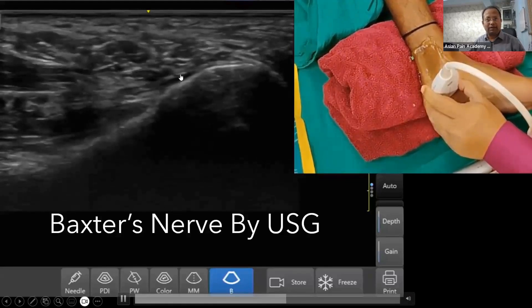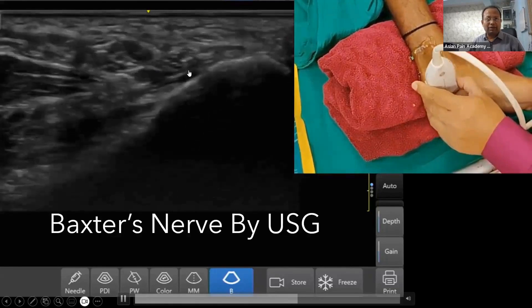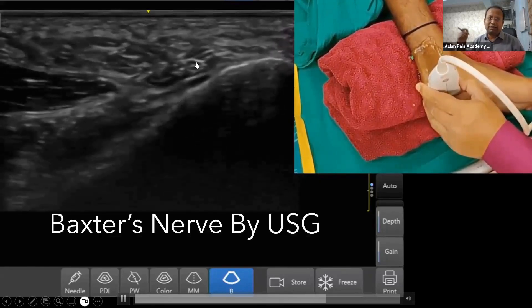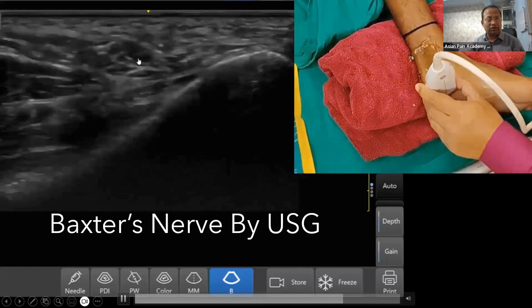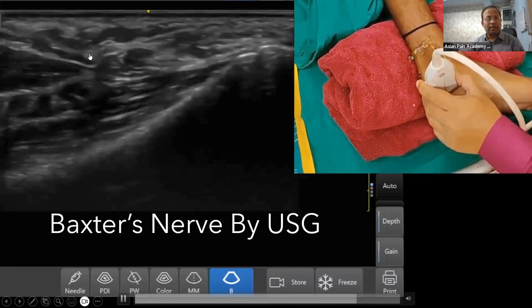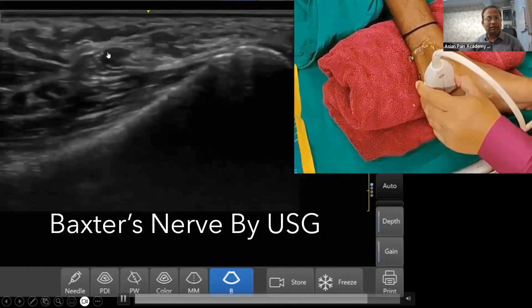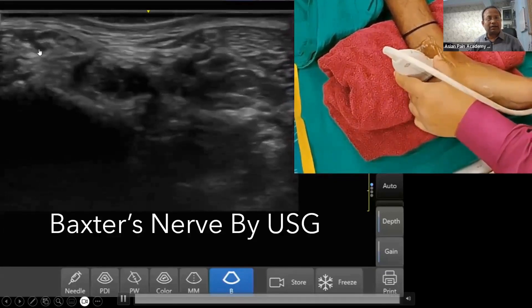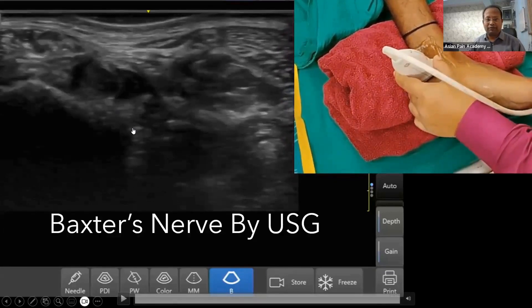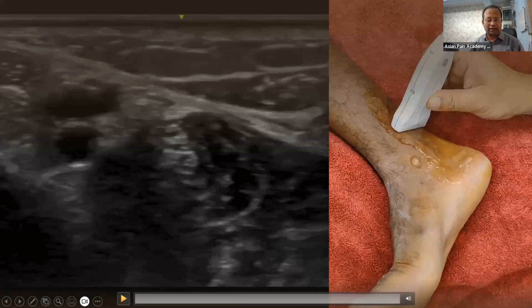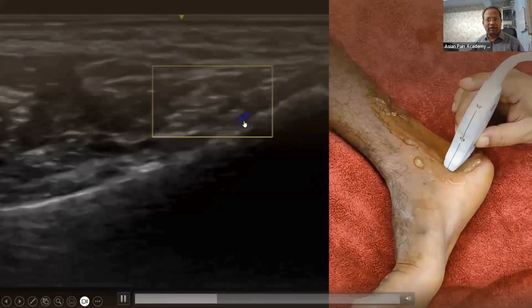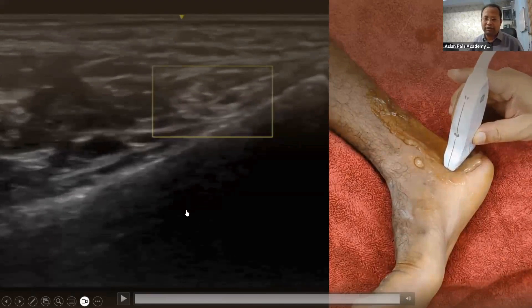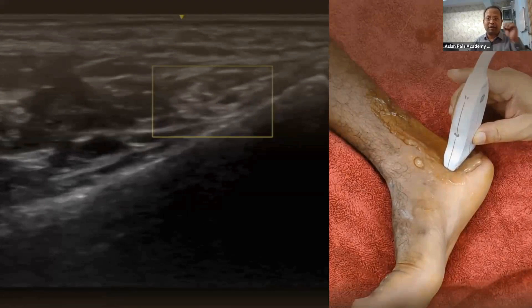We can see the Baxter's nerve here — sometimes it is a bit difficult to see, but sometimes it shows a clear honeycomb appearance. Because of its curvy course, it cannot always be seen clearly. The Baxter's nerve then joins the lateral plantar nerve and ultimately becomes part of the posterior tibial nerve. The Baxter's nerve is also accompanied by a vessel — under Doppler a pulsating vessel can sometimes be seen, and here it is taking color.